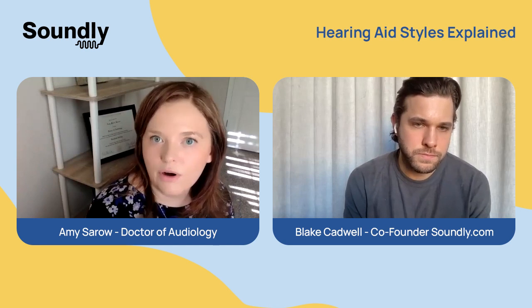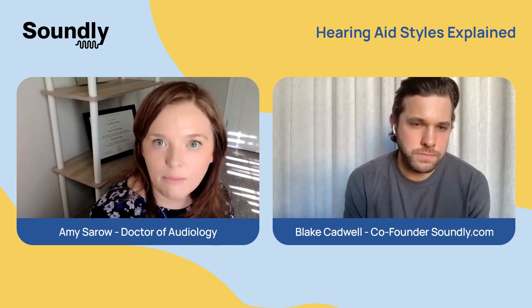So let's move on to the final category that you talked about, and that's implanted products, kind of bone conduction, and then cochlear implants. Can you talk to us about how these products work and who they're right for? So with bone anchored hearing aids, these are going to work best for somebody with a conductive hearing loss, who's perhaps not able to wear a traditional hearing aid. Maybe they need their ear canal to be free to allow oxygen to come in, to prevent further infection in the ear, for example. There's other reasons why, but that's one of the most common reasons.